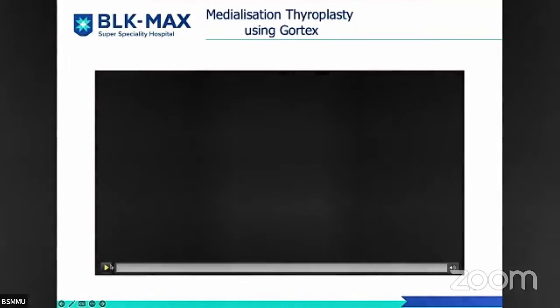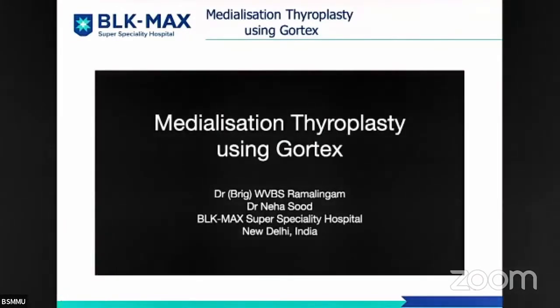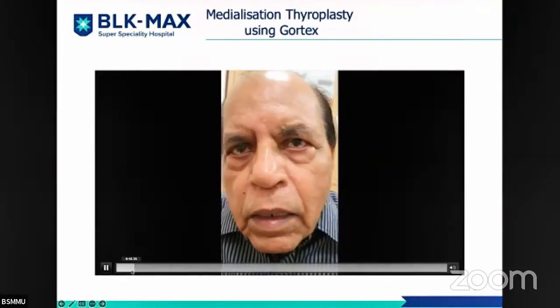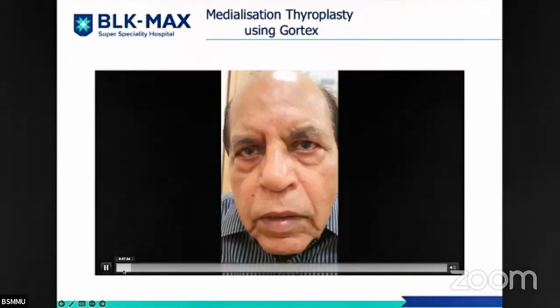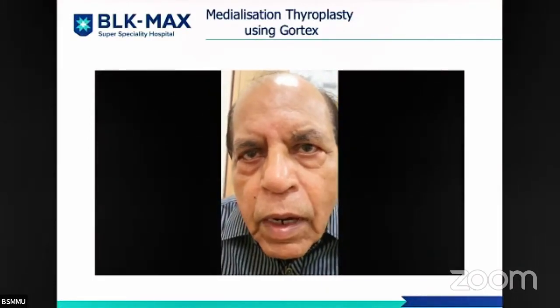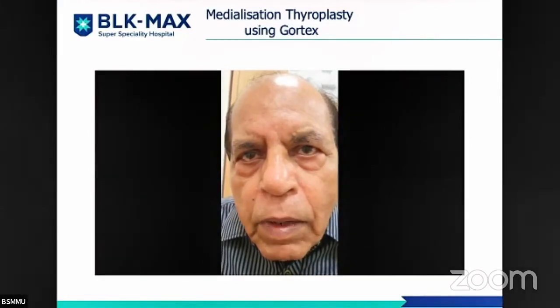Now, as I told you, Gore-Tex. This is a very simple procedure. We are just showing you how Gore-Tex is inserted. Now, why did we do this in this case? This patient had type 5 cordectomy for carcinoma larynx. We waited for 2 years when he was symptom-free, disease-free. We wanted to do a thyroplasty.